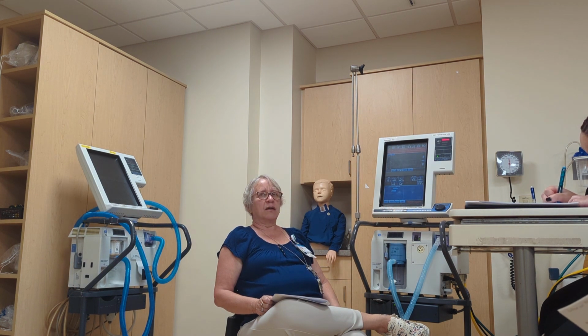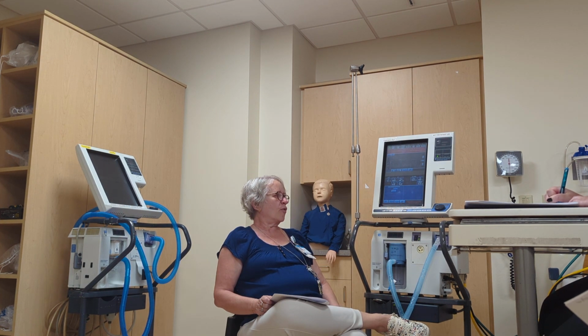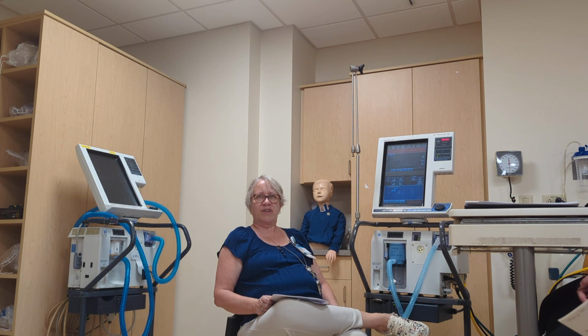So when the doctor orders 500 milliliters of tidal volume to be delivered, how much are we losing? 78. So I'm gonna round it up to 80 real quick. Is it appropriate for me to deliver 420 milliliters? No. If he wants 500, I have to deliver 500.